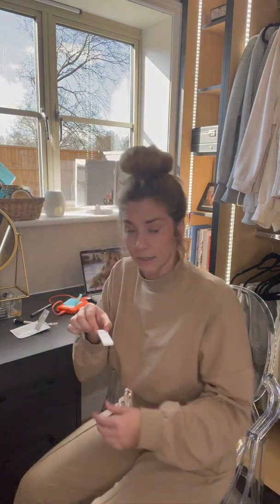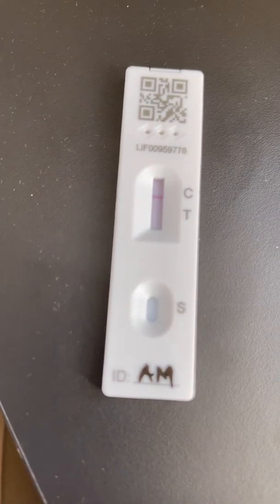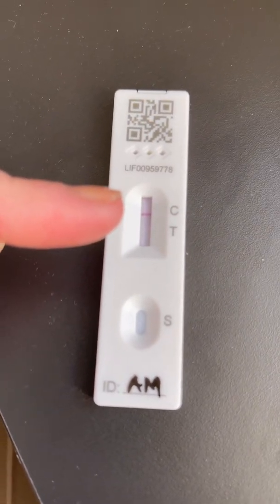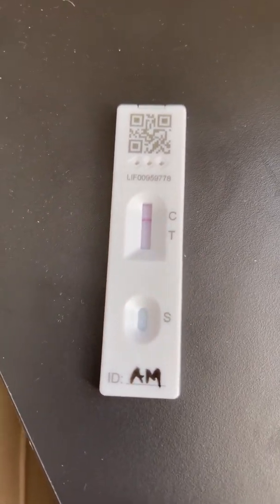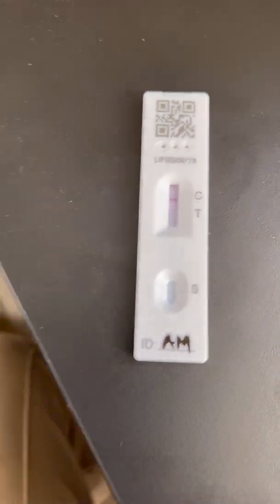Just wait now for 15 minutes. And 15 minutes later — I do not have COVID! The top line means that you are COVID free. If you get two lines — a line on the C and then a line on the T — it would mean that you do have COVID. According to this, I do not have COVID. Yay!